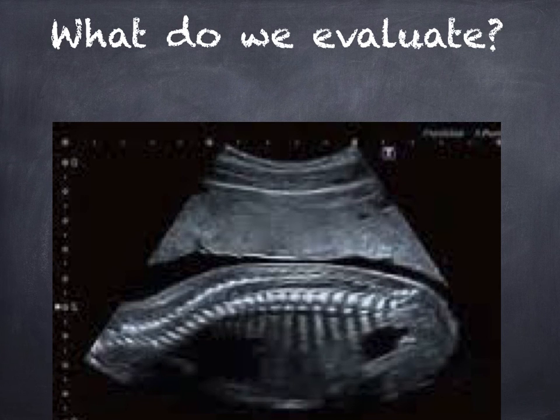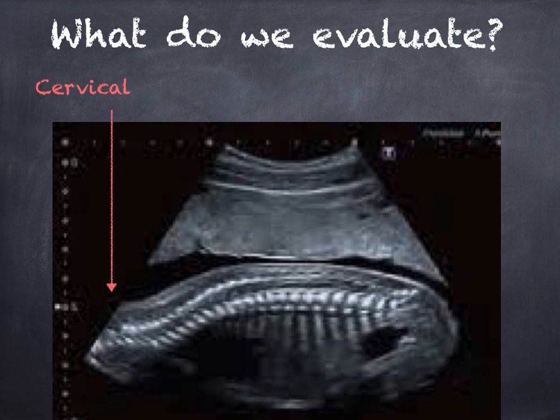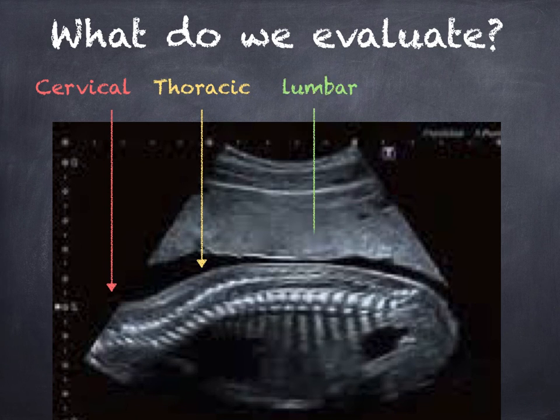Now that we're familiar with the scanning planes, we need to document the four segments of the fetal spine. We're looking for the cervical, which is right at the neck. Below that is the thoracic segment. Continuing down we have the lumbar segment, and at the end of the spine is the sacral segment.